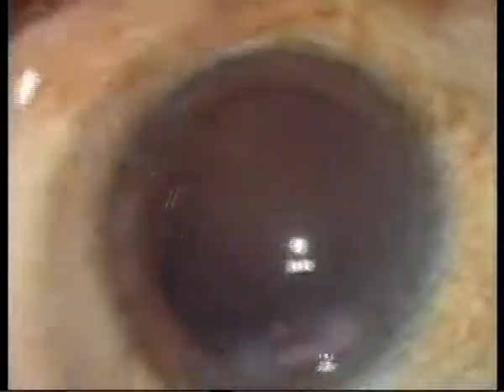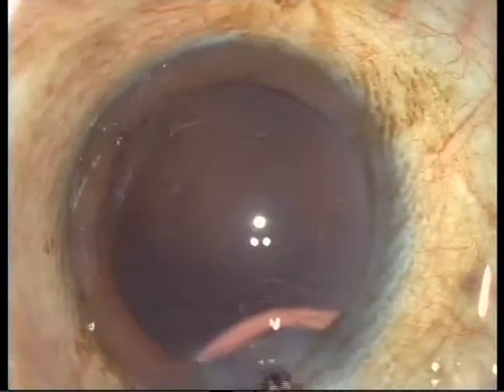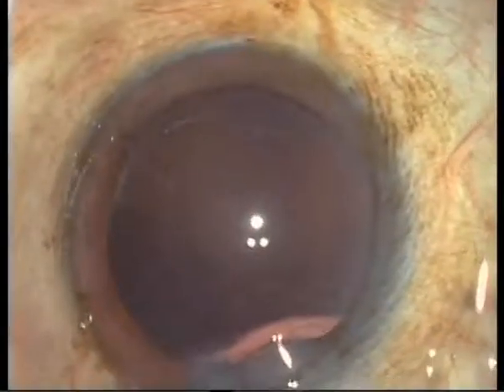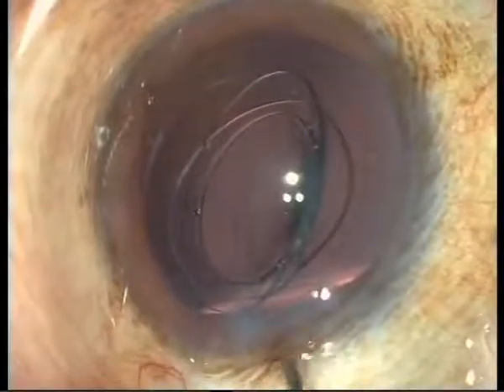I put a little bit of viscoelastic material behind the posterior capsule, then fold the lens and put it in the injector — it's ready to go. To inject it, I lift the incision a little bit. It may be necessary to enlarge it slightly so the patient doesn't feel pressure. Now the lens is injected and will then be positioned where it should be.